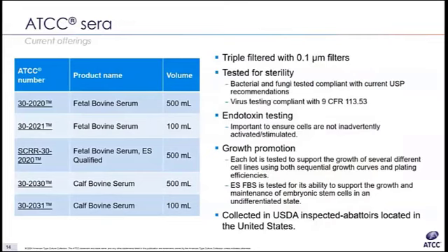All right, so now that we've discussed using authenticated and characterized cell lines, let's talk a little bit about fetal bovine serum. Serum is a pretty critical component in cell culture and often cannot be removed or substituted. In cases where the serum cannot be removed or substituted, it's important to use serum that is extensively tested according to Title 9 CFR 113.53. This is a government guideline from the Animal and Plant Health Inspection Service, also known as APHIS. This requires serum to be tested using a 21-day in vitro test for viruses.